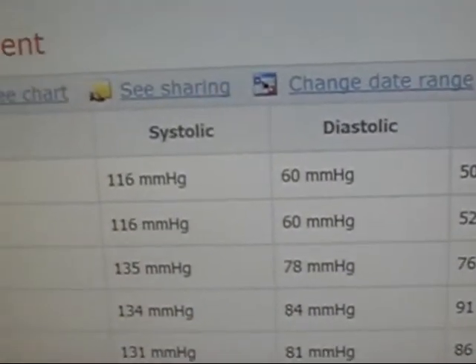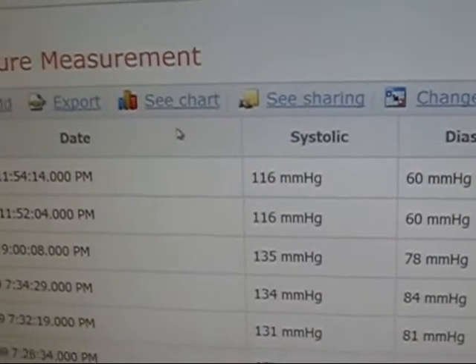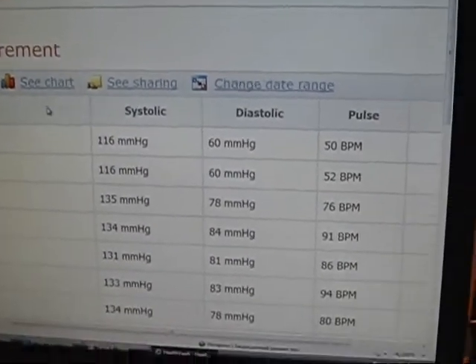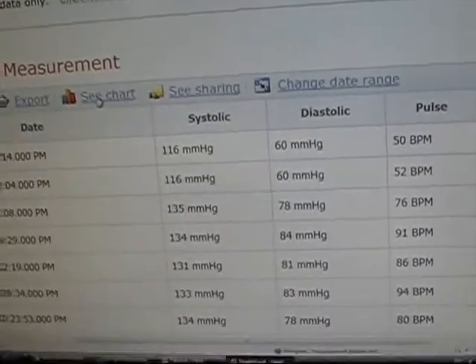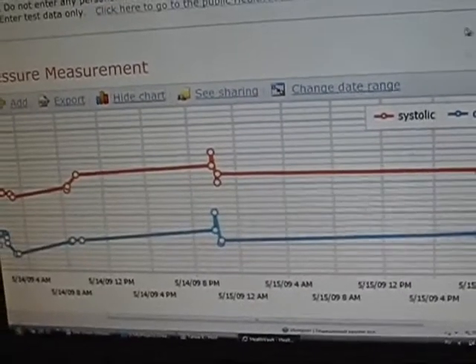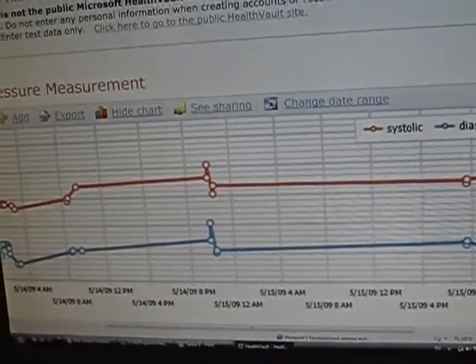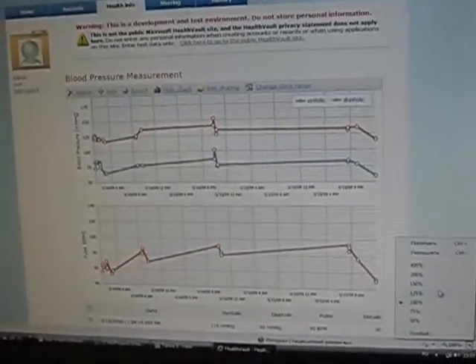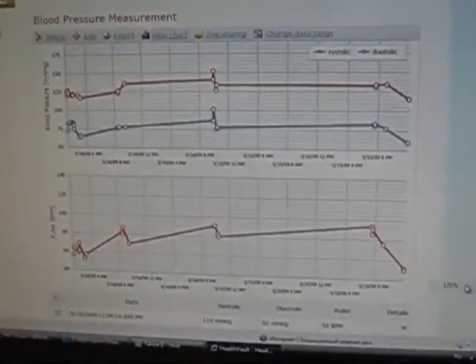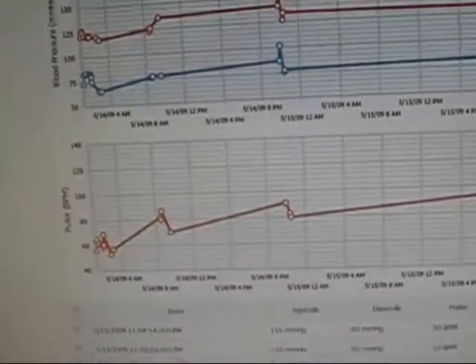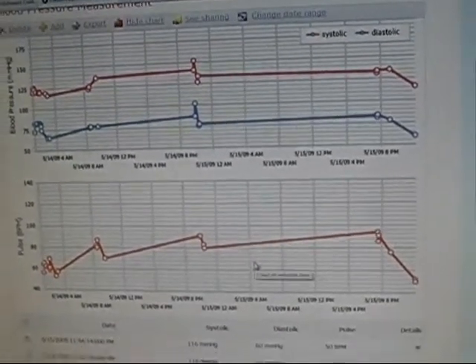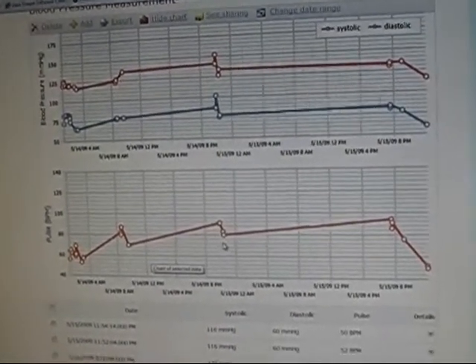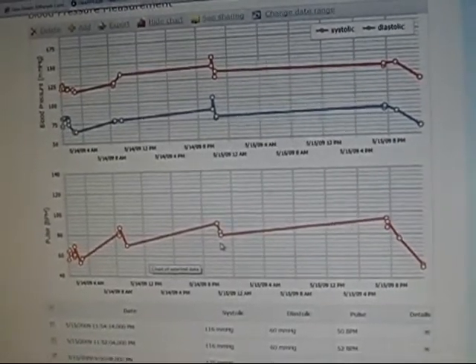This data could be analyzed — we can click the chart and we can see the trends of our blood pressure situation with our health.